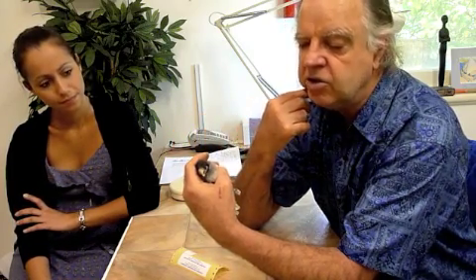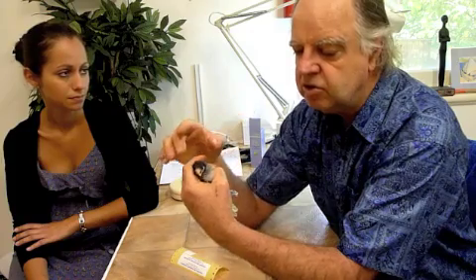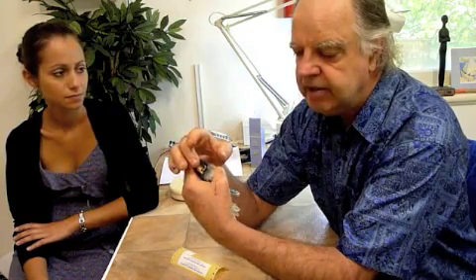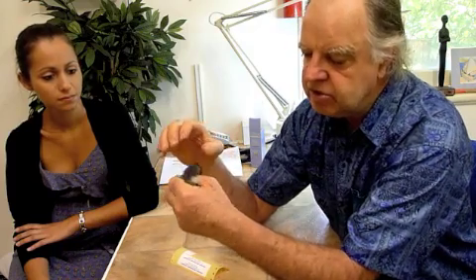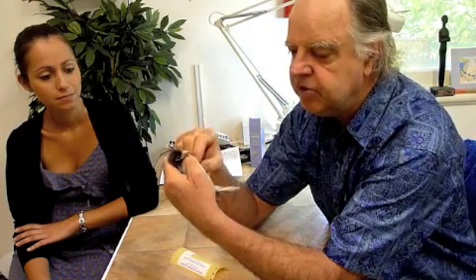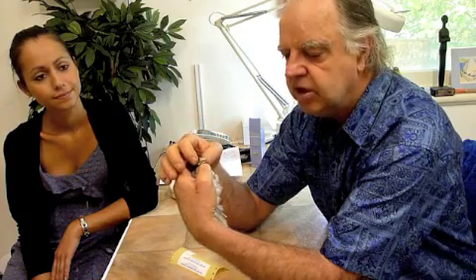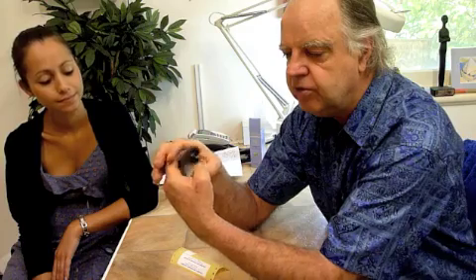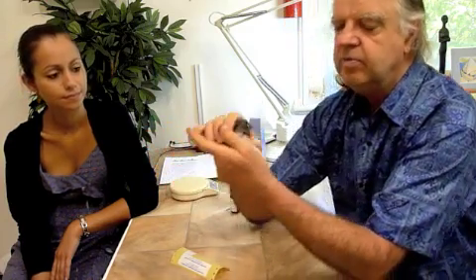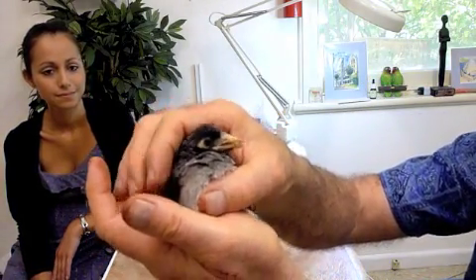Anyway, he's been through the mill. What we've now done is put another pin — an acupuncture needle — down the right lower jaw as well, so he's got a pin in both the left and right lower jaw. The pin in the right lower jaw I've bent up and then put some dental acrylic cement on the tip of his beak to try to keep it at an angle so that when he closes his beak it tends to correct the scissor. I don't know if this is going to work, but it's the best we can do for him at the moment.